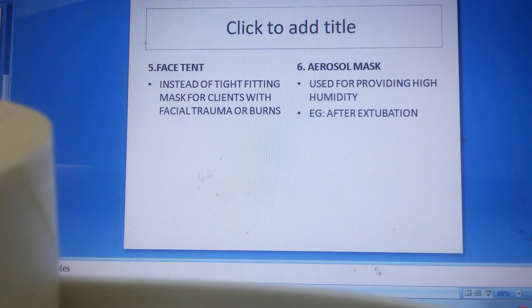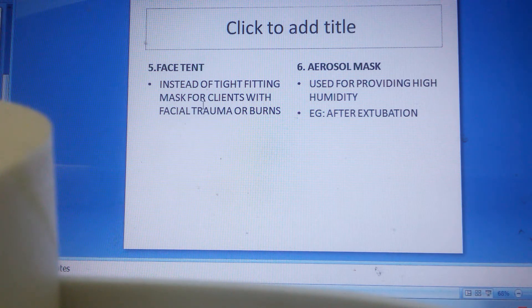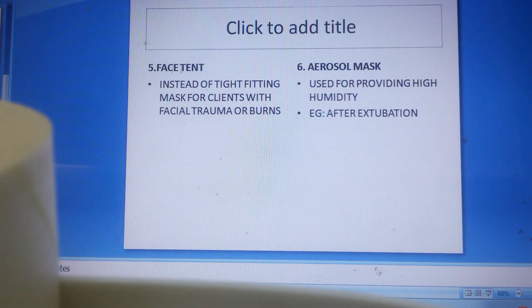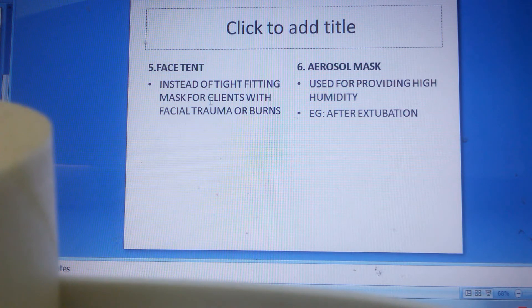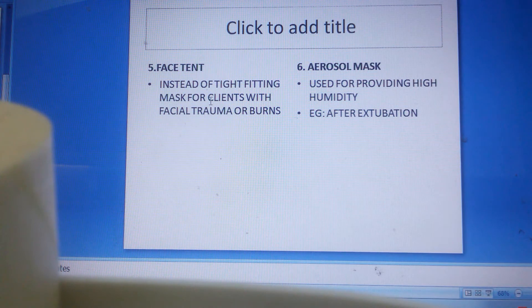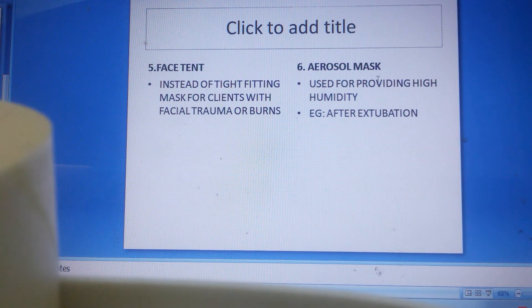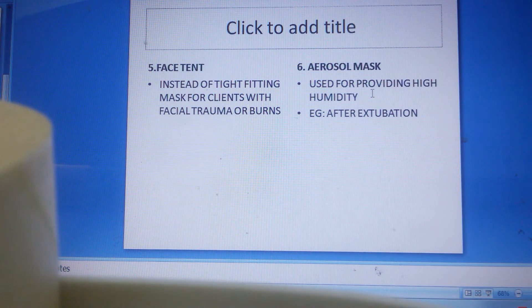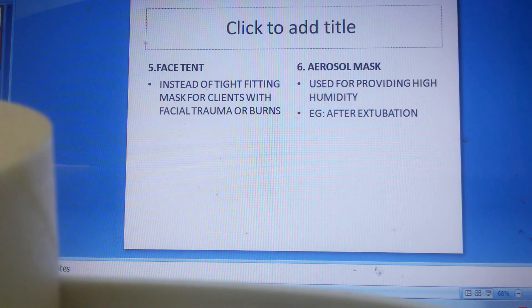Next is the face tent. Instead of a tight-fitting mask, the face tent is used for clients with facial trauma and burns — for example, a client with burns where we cannot fit an oxygen mask. Next is the aerosol mask, which is used for providing high humidity — for example, after extubation to clear the airway.